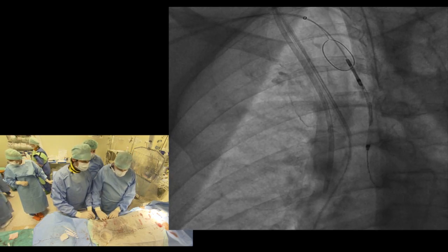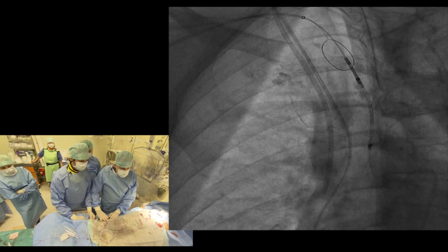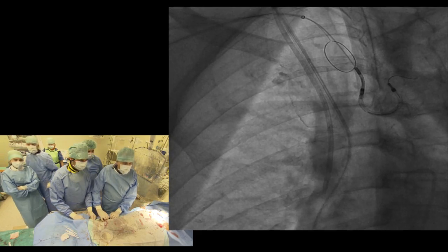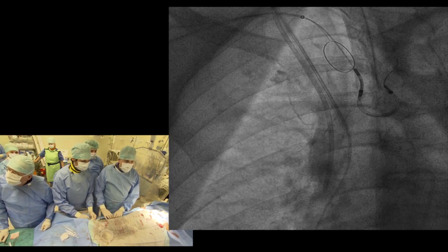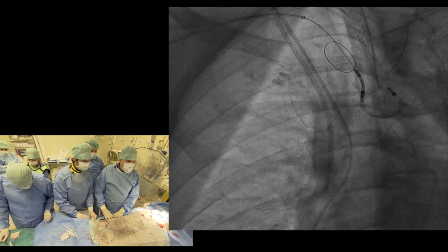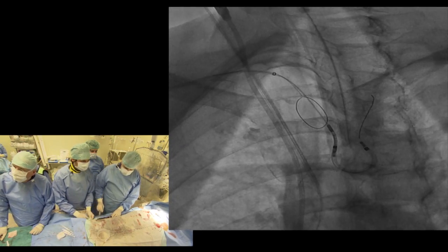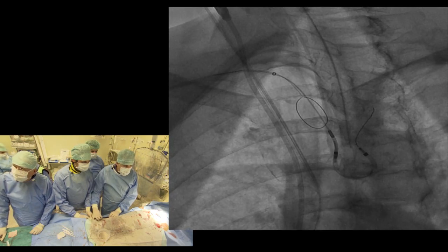Okay, and then we now have to make the curve gently, rotate it and do a curve, but the curve is in another direction. Now we need to twist it, will be good. Okay. Moment. Try to do something. The guide wire. It's going or not? Yes, it is. But it is going to the subclavian artery. Yes, it is. Can we go a little bit downward? Down. Okay.